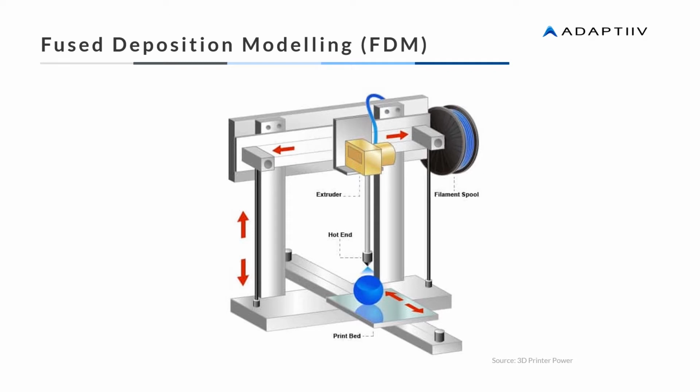As you can see in this illustration, blue filament is fed from the spool into the extruder, which uses a torque and pinch motor system to feed and retract the filament by precise amounts. From there, a heater block melts the filament to a specified temperature and forces this melted filament out of the heated nozzle, which has a specific diameter. The printer head then extrudes the filament material according to pre-programmed positions as specified in the 3D printer slicing software.